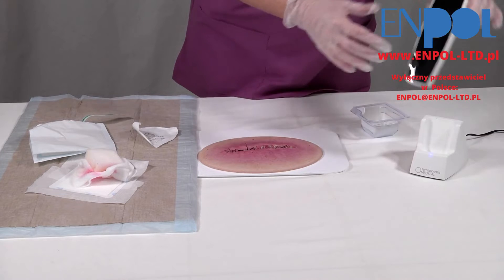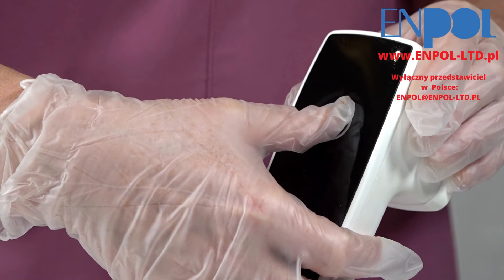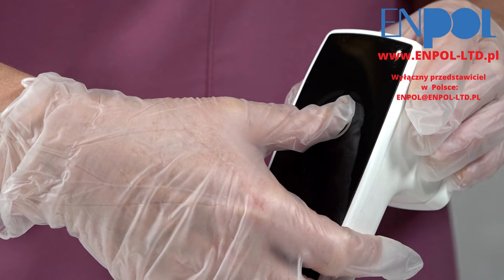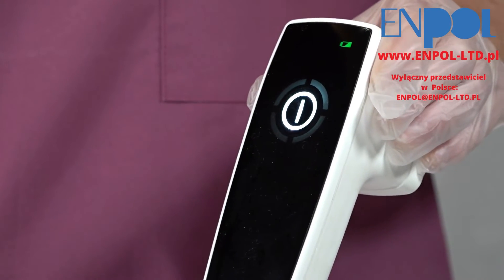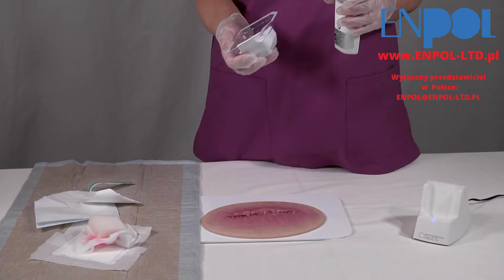Now you can start to prepare the PlasmaCare device for treatment. Switch on the device by pressing the touch button. Open the sterile spacer blister pack and fix the spacer to the device head.